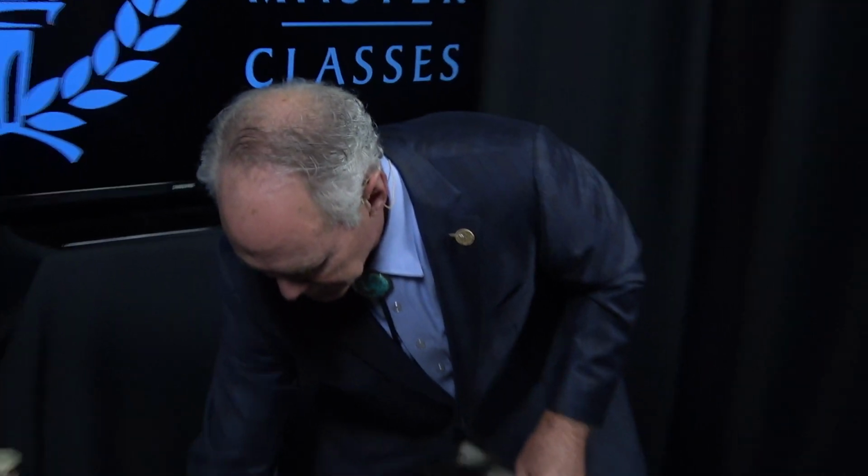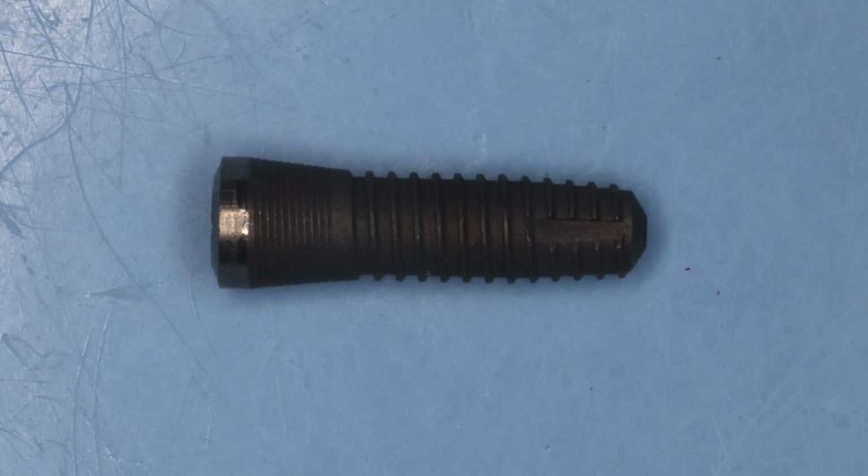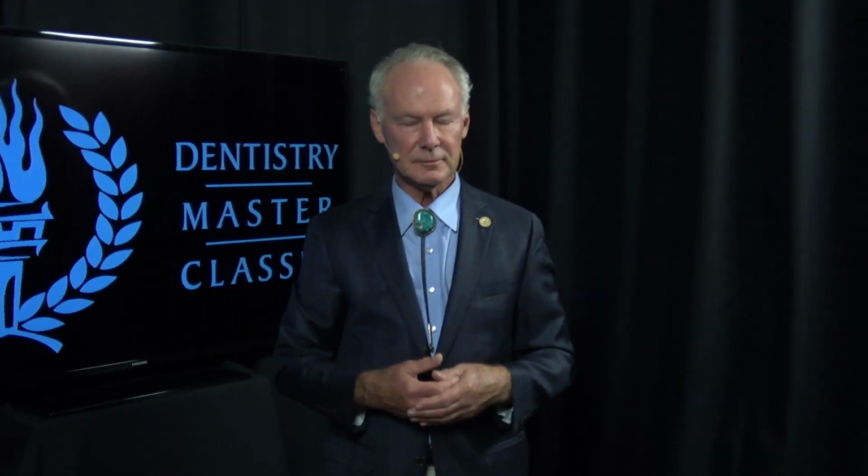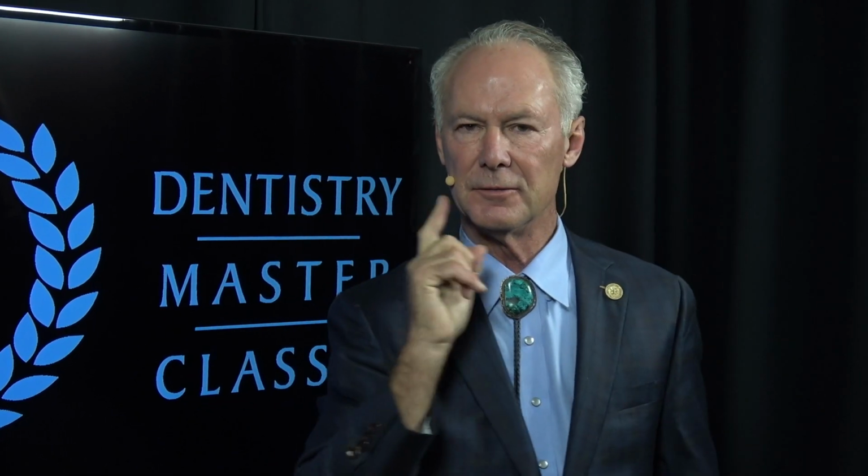This is what implants look like, by the way. This is a root form implant, and these actually screw into the bone like this. For me personally, this is the way I look at implants. I normally don't like implants in the aesthetic zone. That means from cuspid to cuspid if the person has a high lip line when they smile. I mean, if they show the gum tissue, because it's very difficult to get the gums exactly right.